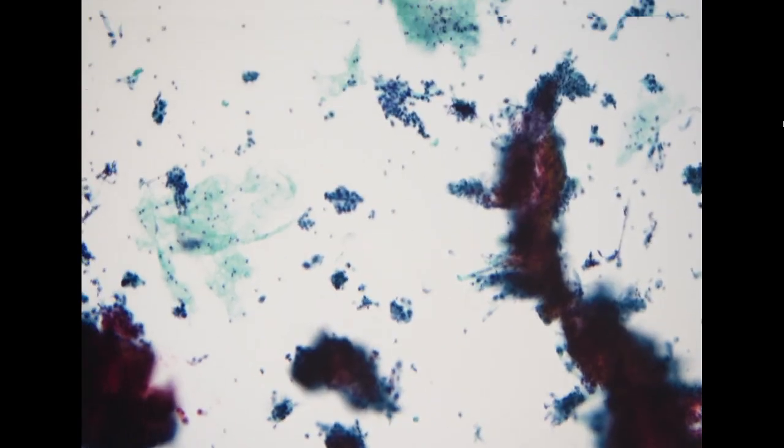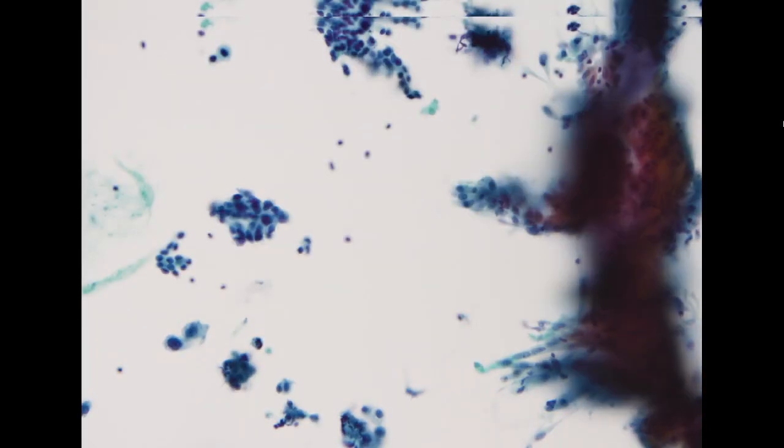So the next specimen is coming from a parotid aspiration cytology. On low power, we see hypercellularity and a lot of cells in very tight aggregates, and it looks very dark. On low power, it looks positive for malignant cells, positive for carcinoma.